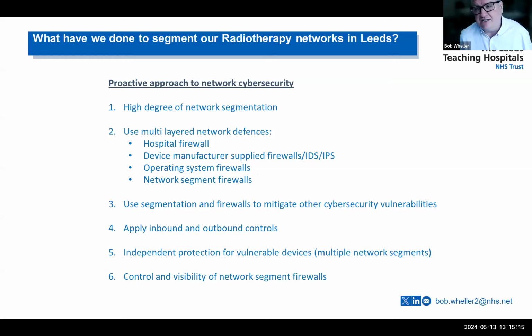So we're a medical physics department, and we're working closely with the datacomms department. The datacomms department own and manage our networks and our firewalls. But by collaborating with them, we've got oversight. We can see what's going on. We can access those firewalls.